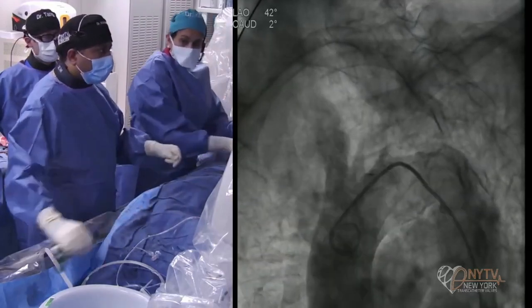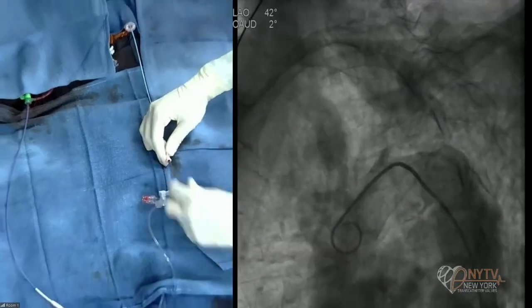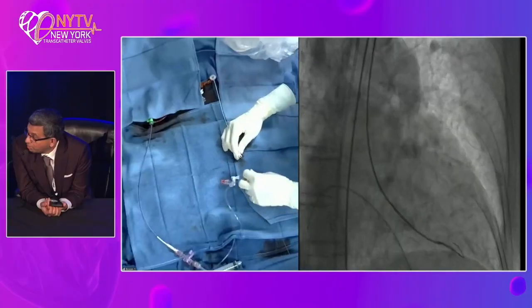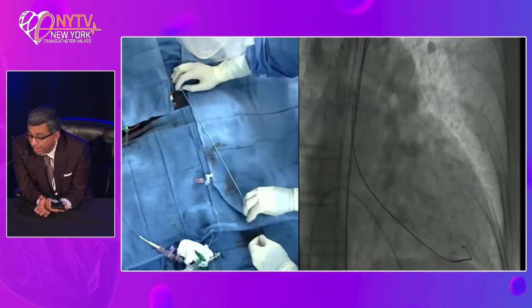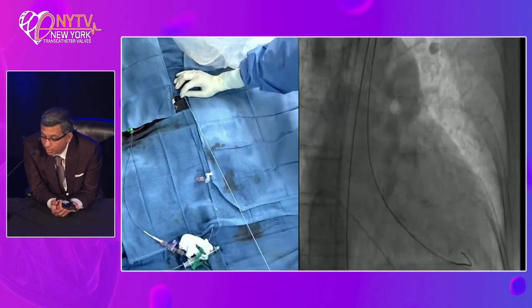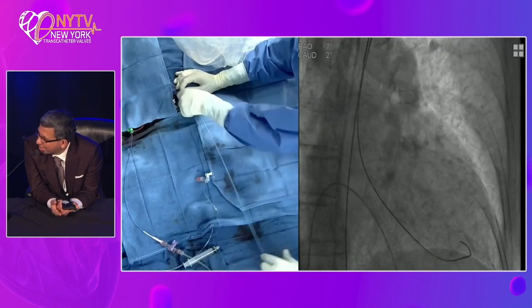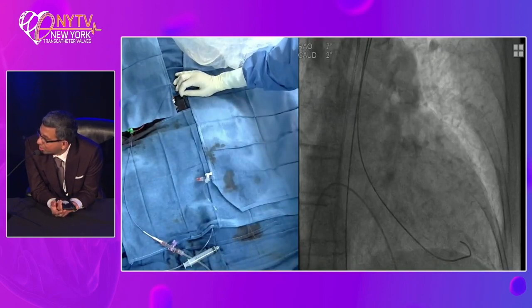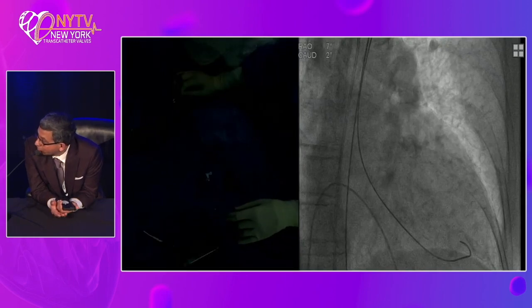We needed your personal opinion. I would. I don't even do an angiogram, I just look at the CT scan, but I would definitely try in this one. But again, this patient does not have much calcium. We are treating mostly AR, mixed valve disease, so maybe the risk benefit is not in favor of putting a Sentinel device, because the aortic valve is not super calcified.